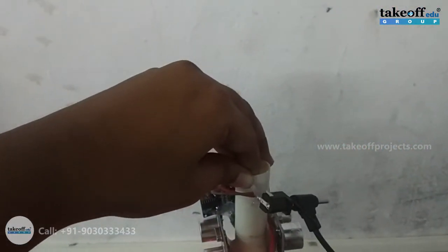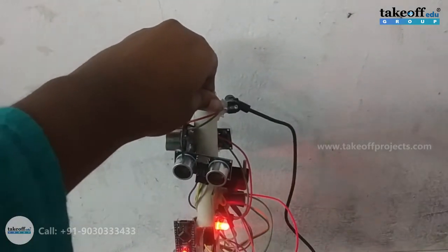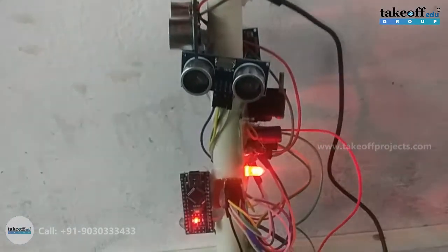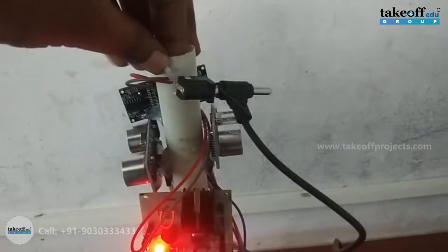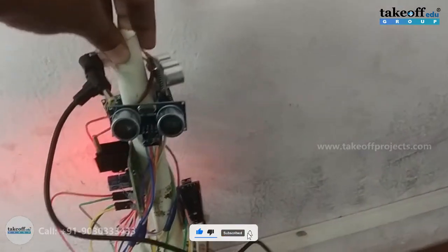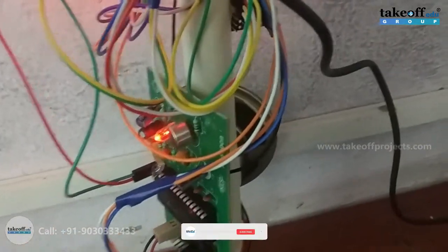So for the front obstacle, to show it forward. And let's see for the right side — 'Right obstacle.' Now let's see for the left side — 'Left obstacle.'